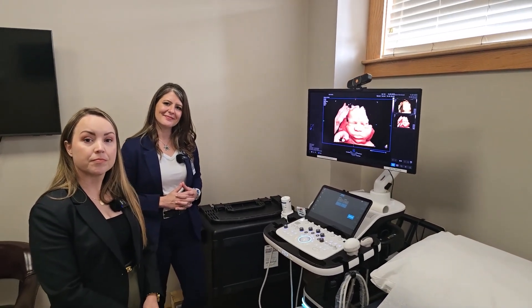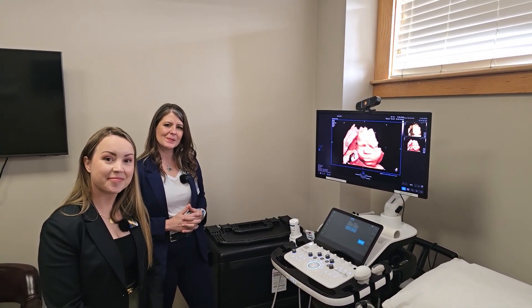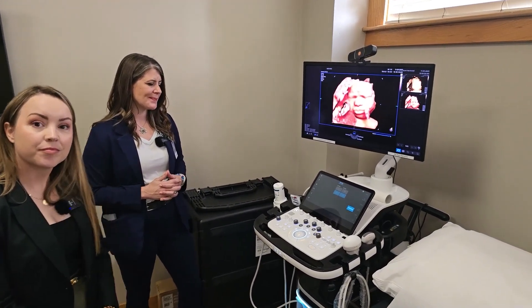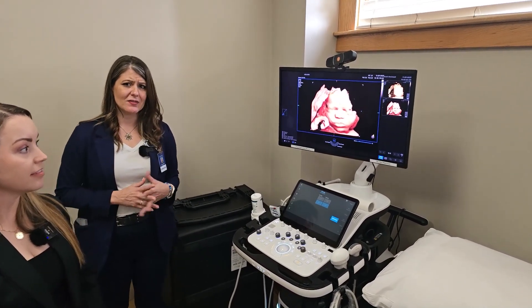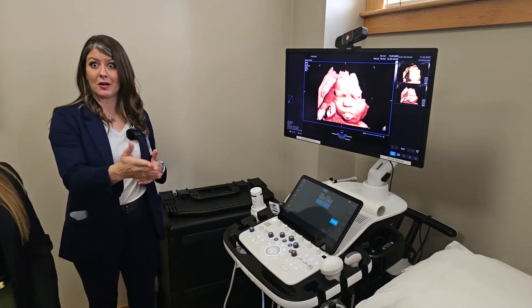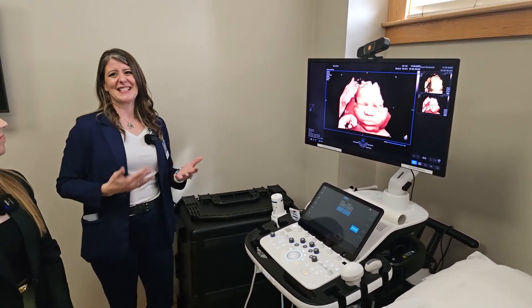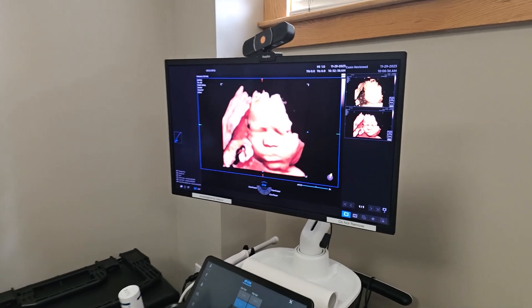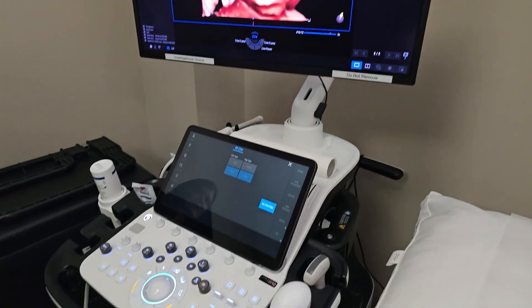There are often complications where you have to take shot after shot — maybe you think the cord's wrapped around the neck. It's very uncomfortable for everyone involved. With 4D, you can actually see the baby moving, which eliminates a lot of those questions. You can also see the fetal heart, detect which way the blood is flowing using color — blue away, red towards — that's the acronym BART. It's incredible that you can see your baby, check the heart, and evaluate anatomy while the baby is still being created.